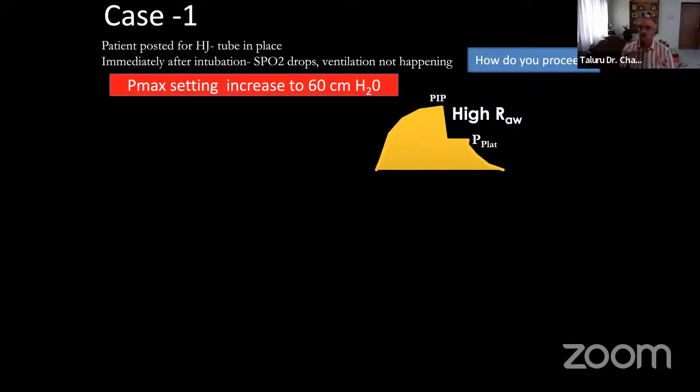So look at the contribution of the airway. So much of spasm is there. Now you know that PIP is not troubling. It's not going and eating your alveoli, isn't it? If the alveoli is being overstretched, your P plat cannot be normal. So how do you manage?